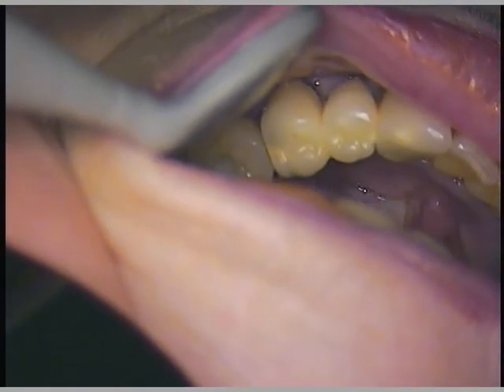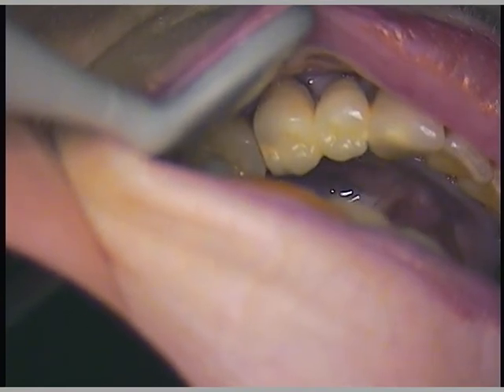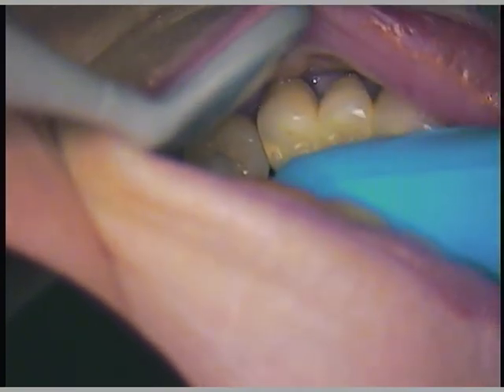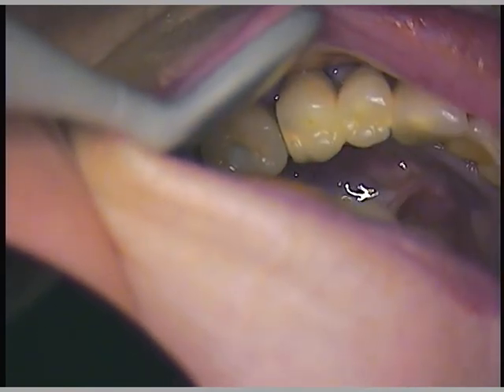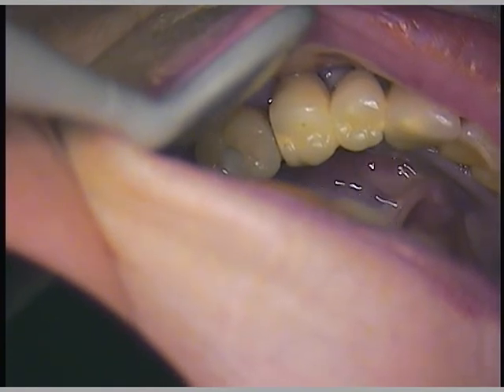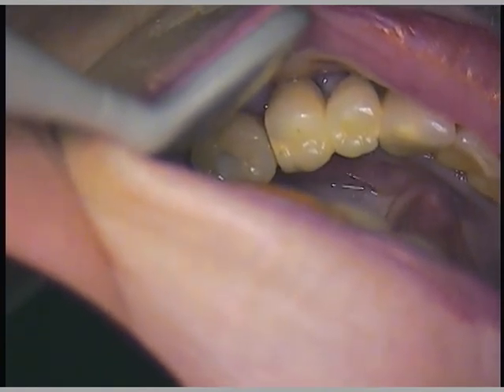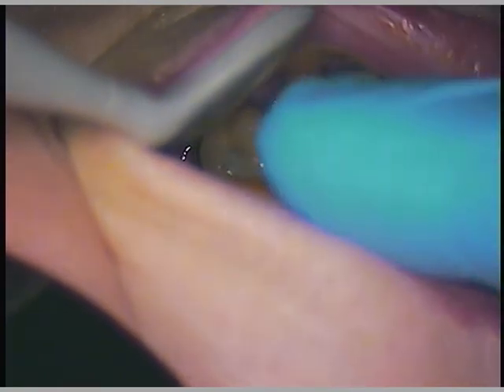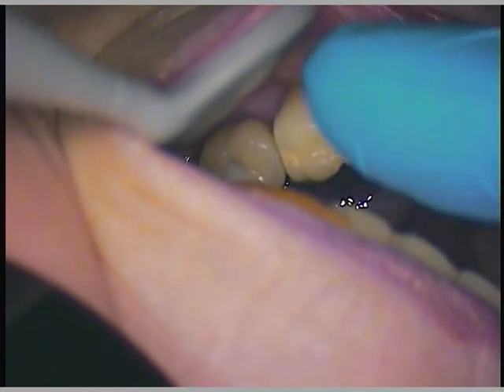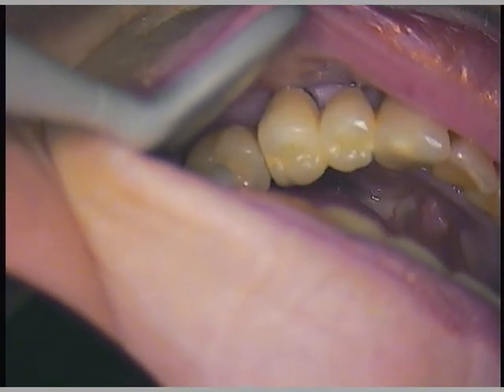We replace the loose screw and then go from there, and it shall have a much better situation with fewer issues. The Branemark design — we're looking at either the 1980s or 90s when that was first used and designed — has now been eclipsed by the Nobel Select Design and Active Design.